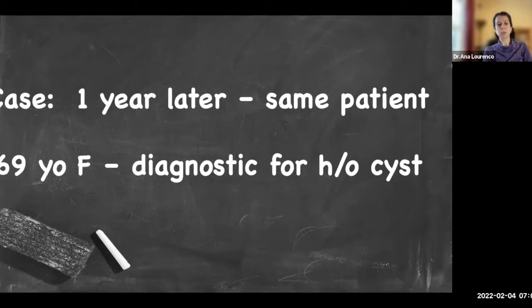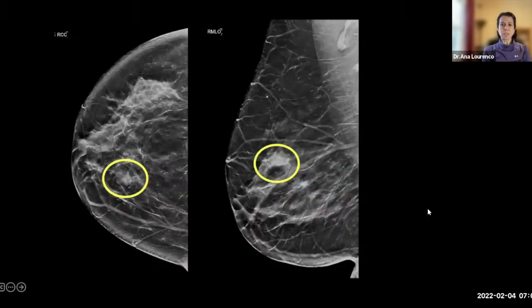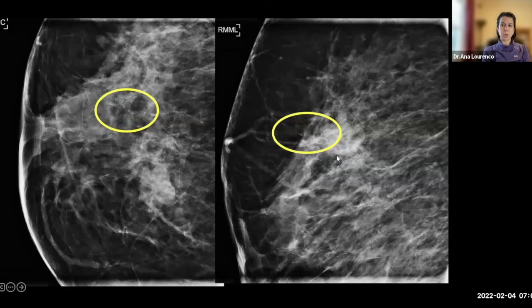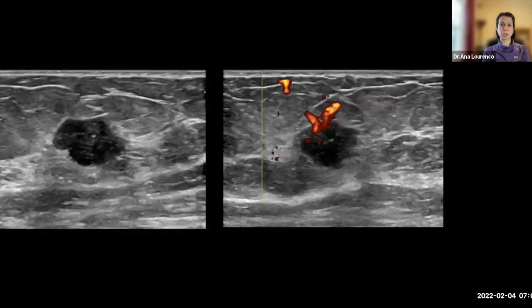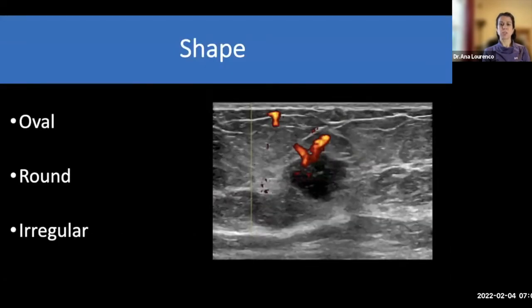The same patient comes back one year later — now 69 years old — for a diagnostic mammogram for history of cysts. We see a mass in the upper central breast, and also some new calcifications in the upper central breast as well. So we take her to ultrasound, and we're going to use this mass to go through the BIRADS descriptors. The first thing to assess is shape, with options being oval, round, or irregular.